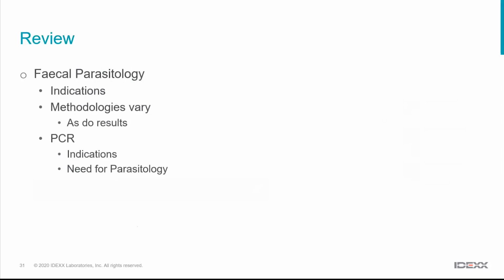So, a fecal smear or wet mount, useful for some Giardia patients. Not perfect sensitivity, but if you find it, that's great. Not finding it doesn't rule it out. A fecal float in clinic is better than doing no parasitology at all, for sure. But we've got better techniques we can do in the lab with the flotation centrifugation. We've also got the antigen profile, which takes it to the next level now. We've got the PCR. So we talked about the indications with certain acute or chronic diarrheas, but really also important to add the parasitology with that.